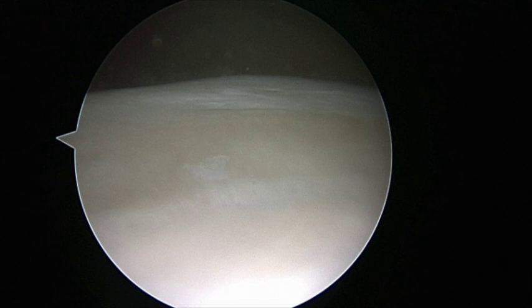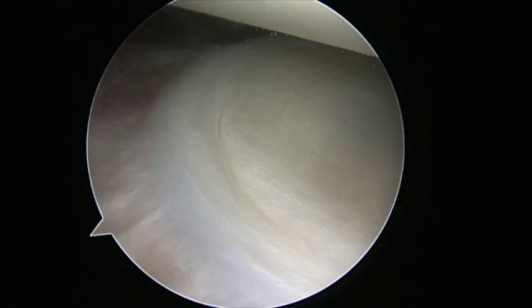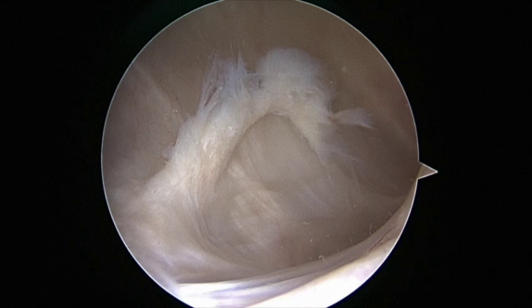glenoid. Diagnostic arthroscopy through a posterior portal shows that the anterior and inferior labrum are normal in appearance. In the anterior-inferior quadrant, the avulsed anterior band of the IGHL is seen retracted laterally and distally.